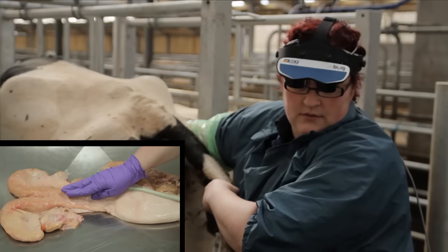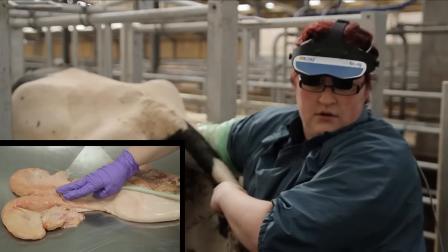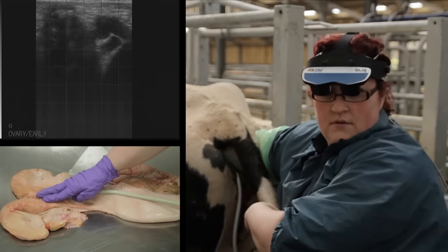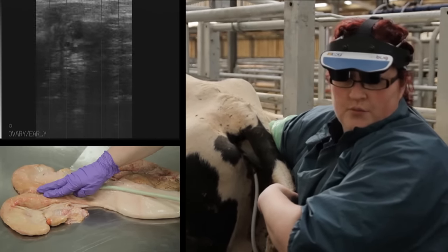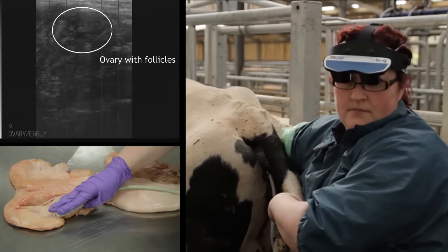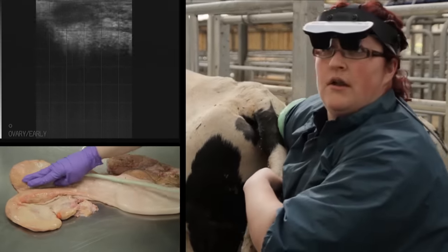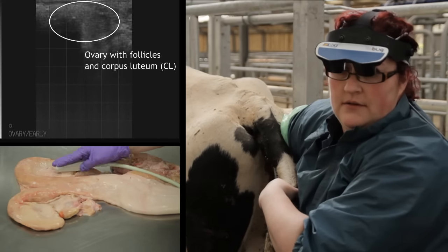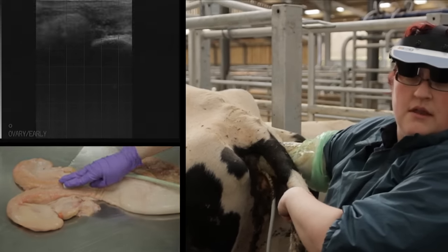Ensure you have good contact. Come to the body of the uterus, travel up one uterine horn up to the ovary, come back down to the body of the uterus, up the other uterine horn, evaluate the ovary on that side, and back to the body. Then out once more.